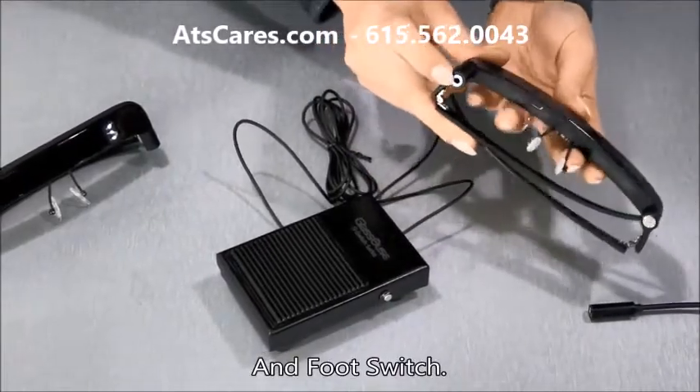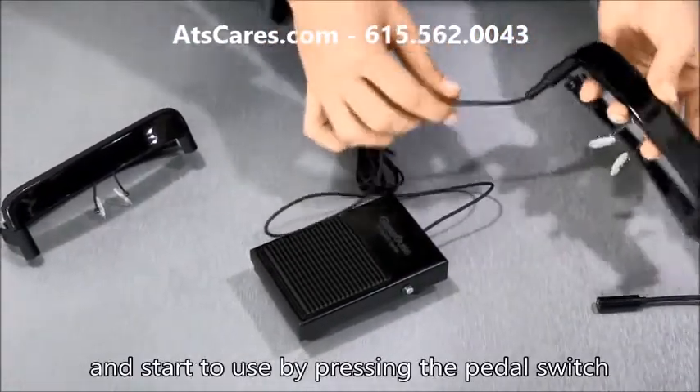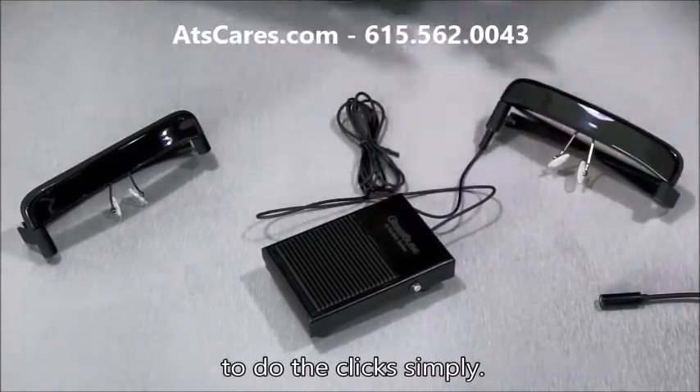And foot switch — use a jack cable to connect your switch to Glasshouse, and start to use by pressing the pedal switch to do the clicks.